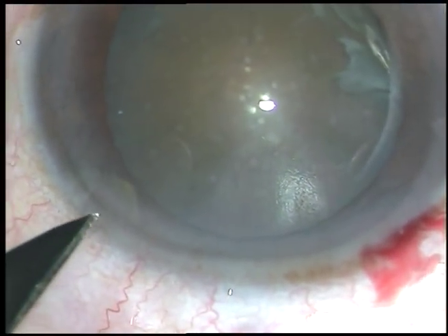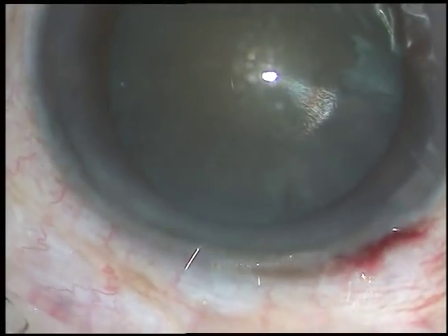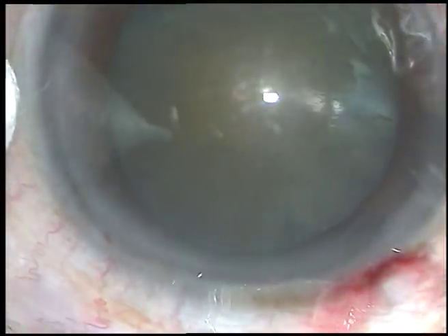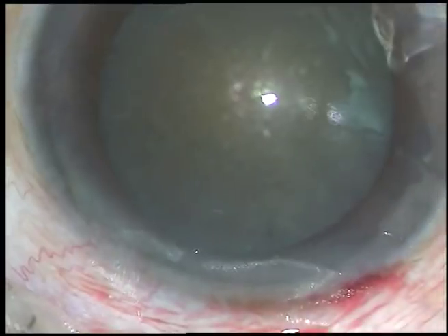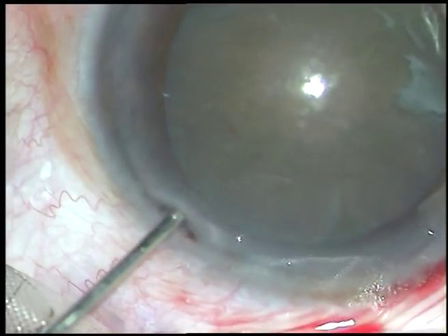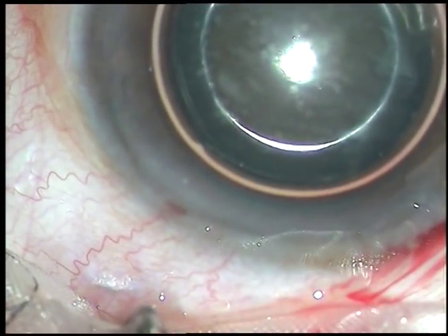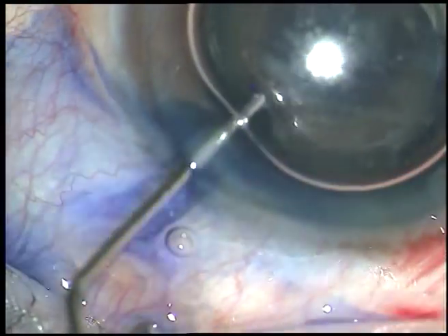This is a cataract with grade 4 nuclear sclerosis. In such cases, in cataracts of this density, I usually do what I call submarine chop. Submarine chop is a technique to divide the nucleus at one go without making any trench.